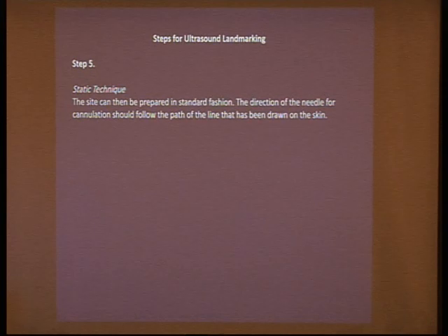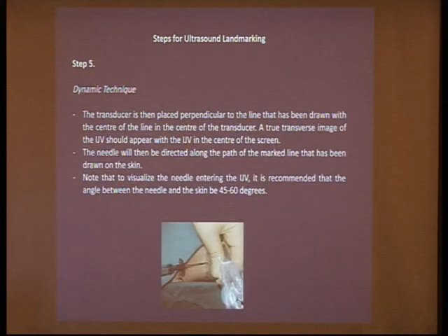and then either to leave the ultrasound machine and go through this line, and this is called static technique, or to use dynamic technique, which could be through transverse view or longitudinal view.